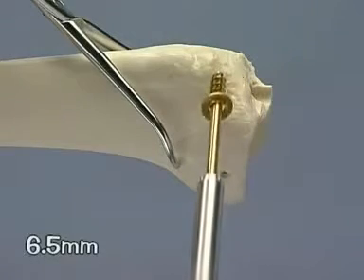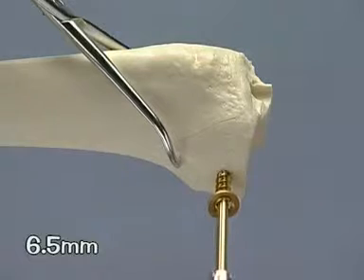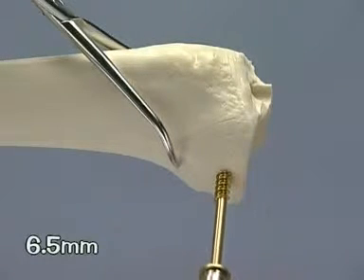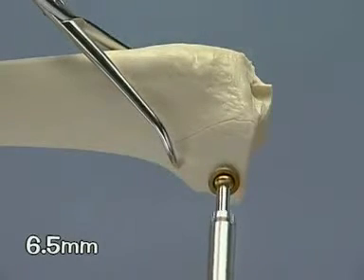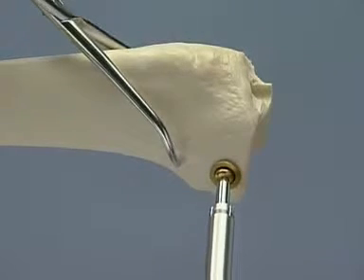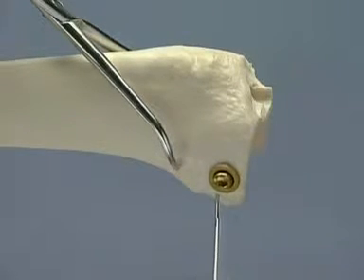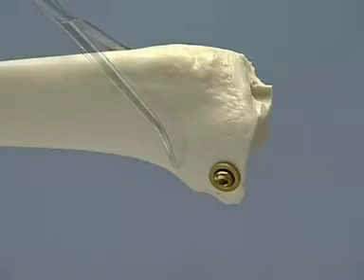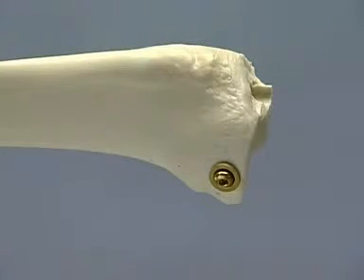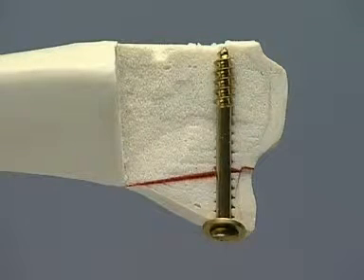Insert a 6.5 millimeter cancellous screw with short thread and washer. The threaded portion of the screw must finally be positioned beyond the fracture. The desired compression is achieved by tightening the screw. If the consistency of the bone is dense, a washer may not be required. Remove the K-wire and the reduction forceps. Note the position of the threaded portion of the screw.